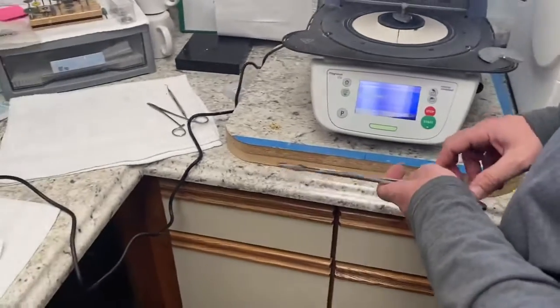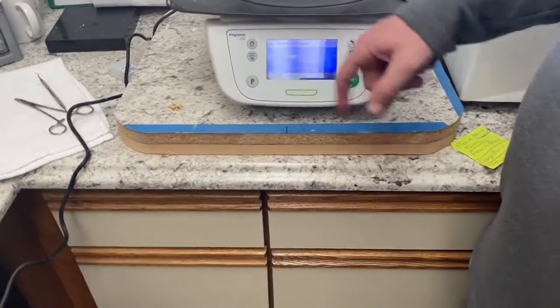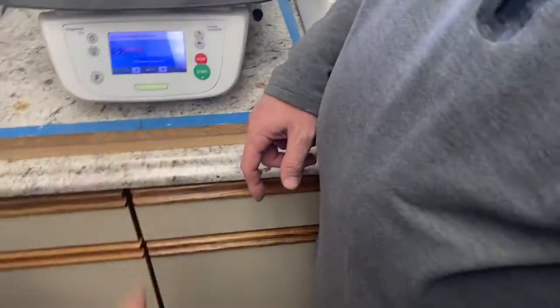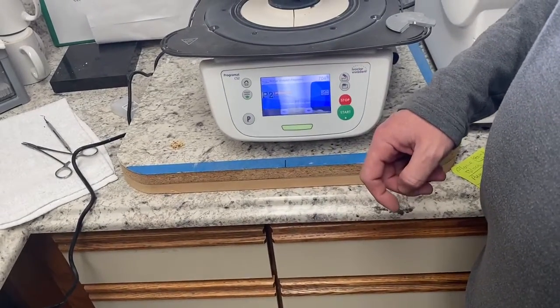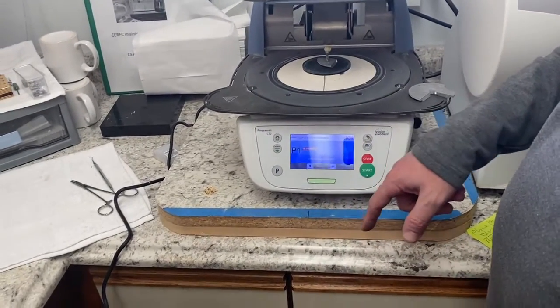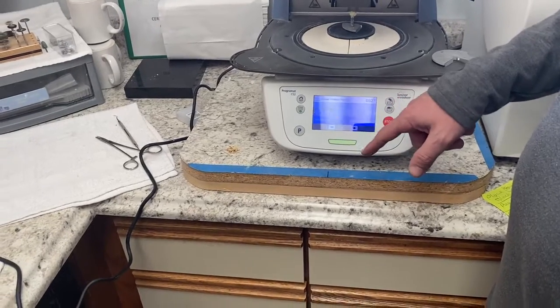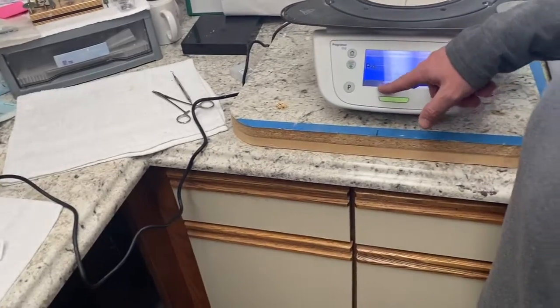Now it has to say P3. You see where it says EMAX CAD P3? That's a program, so when you change your program, now we have 2, and I don't know what we use 2 for. P2 is for correction firing, so if you need to add contact material, or if you need to change the color. So we have a little bottle of contact, if the contacts are too thin. And then P1 is for multiple. So when you have multiple crowns, you go to P1.